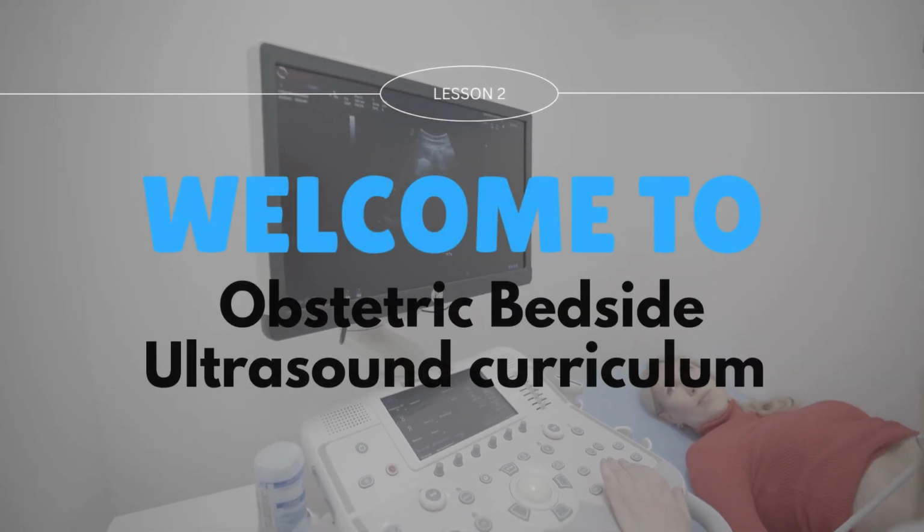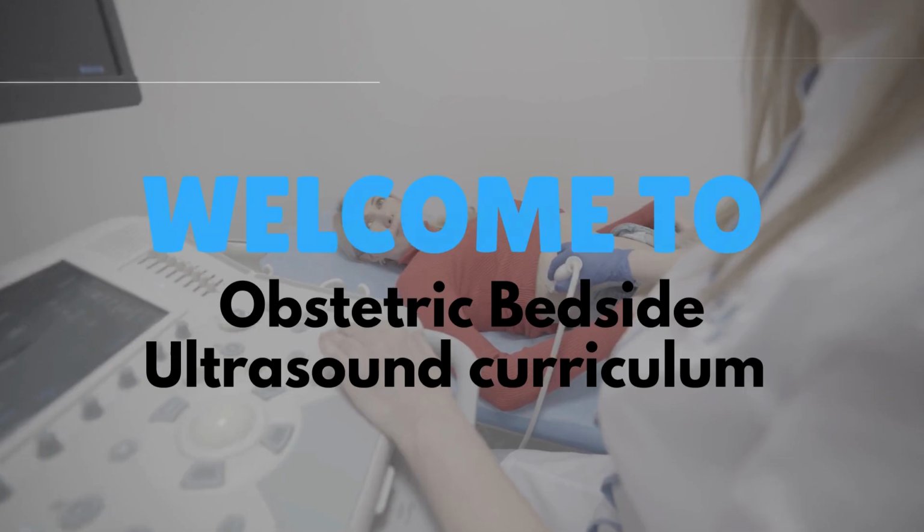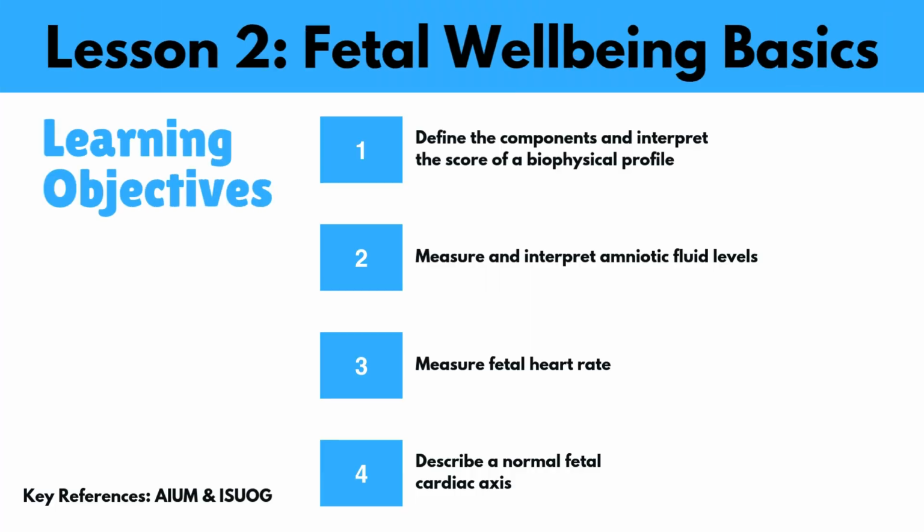Welcome to our Obstetric Bedside Ultrasound curriculum. We've put together a collection of our favorite online educational videos to master 4 learning objectives on fetal well-being basics.